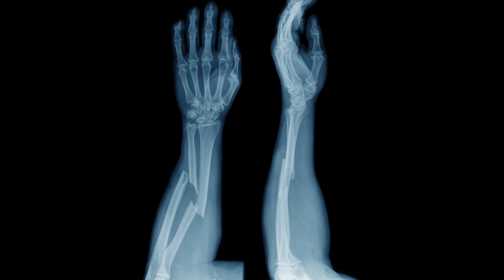You might have come across X-ray and CT scanners. These tools allow us to see the structure of the inside of our patients' bodies. You get to see the bones and the organs. You can see here a picture, an X-ray of a patient's arm, and you can see unfortunately that this person has broken this bone. PET scans don't show us where our organs are.